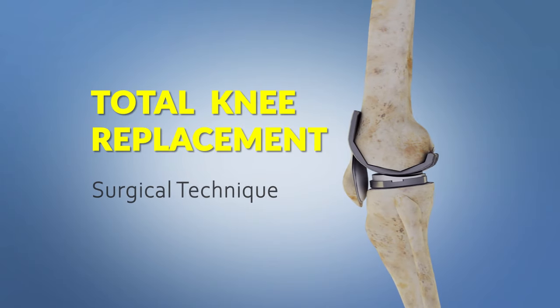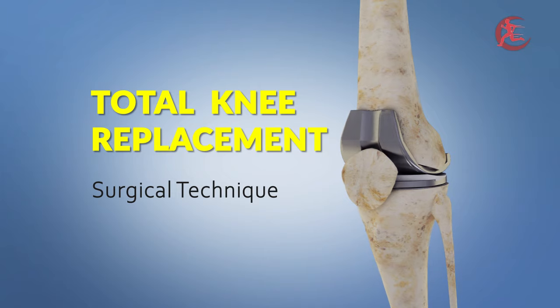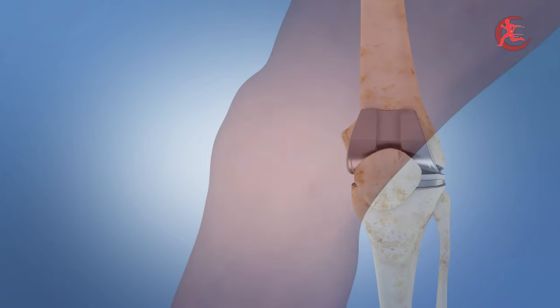Welcome to the amazing world of total knee replacement. Today, we'll take you on a journey through the intricate process of this transformative surgery.